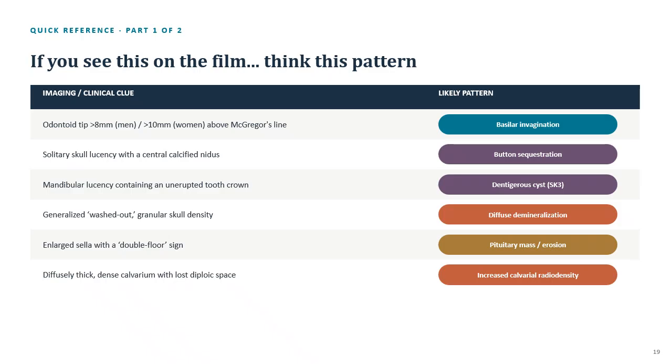So again, these are just some signs or some clues. We're not trying to diagnose, but of course, in our job, we're going to see some of these things. Even though skull imaging might be few and far between, just because a lot of these patients go to CT now, there may be opportunities that we see these things, and this just gives us an idea or a clue on what normal looks like versus abnormal looks like.